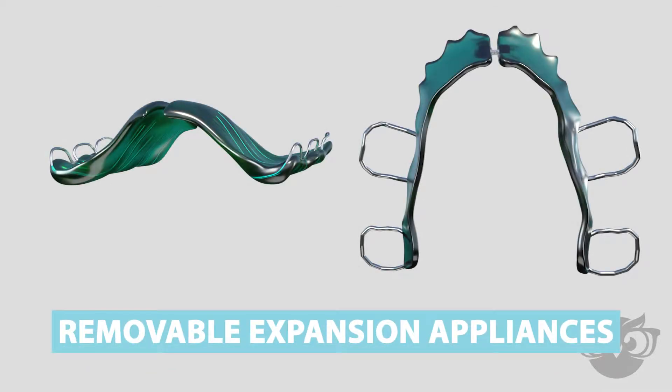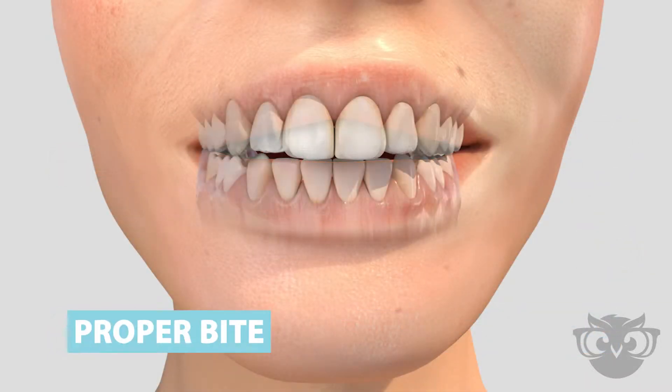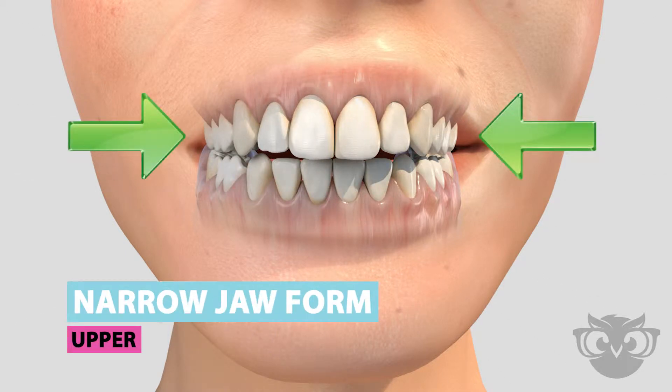Removable Expansion Appliance. A narrow jaw form can result in insufficient space for teeth or an irregularity of the bite.